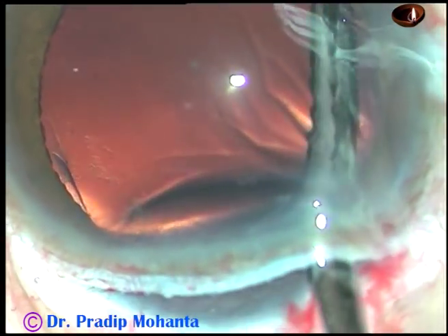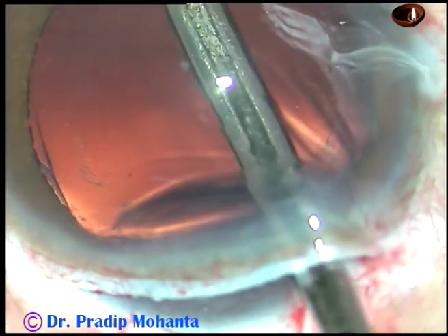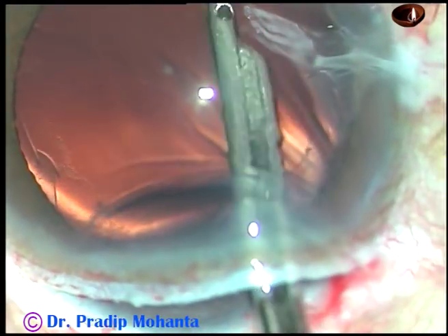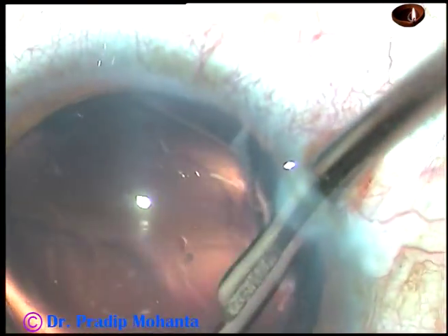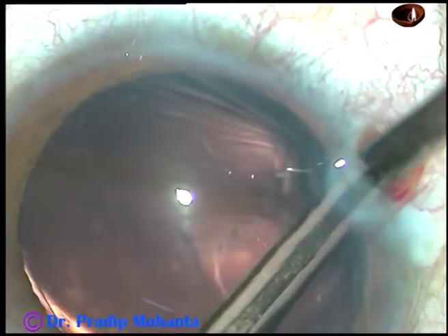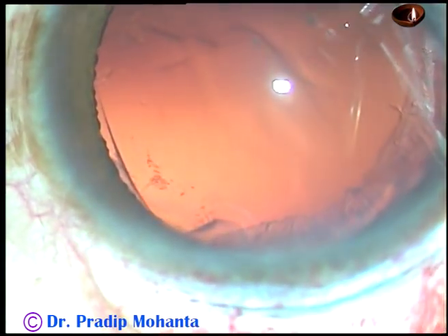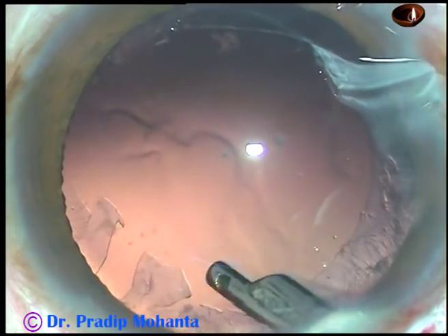If you just lift the anterior lip of the incision, a lot of cortical matter can be removed. Now go through the side port and remove the cortex from the superior aspect. Cortical cleanup is done very nicely.